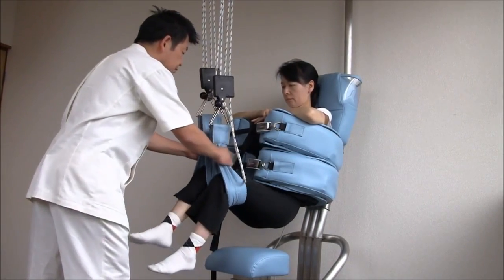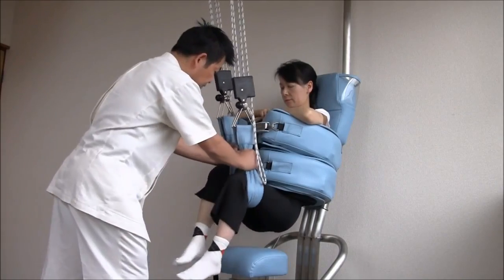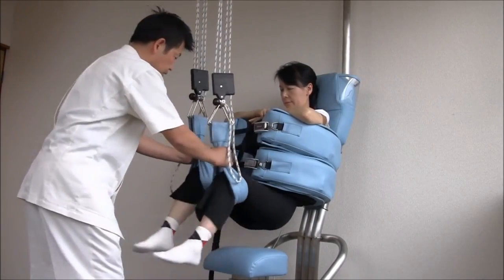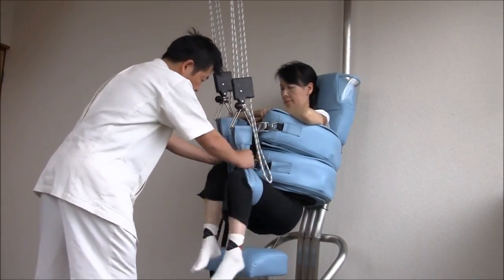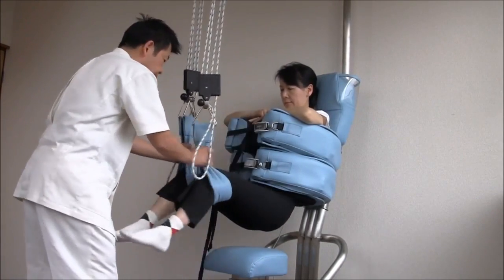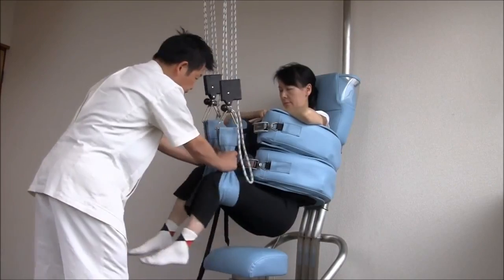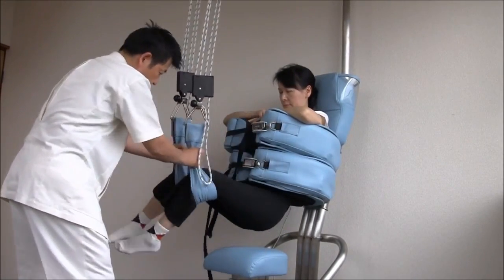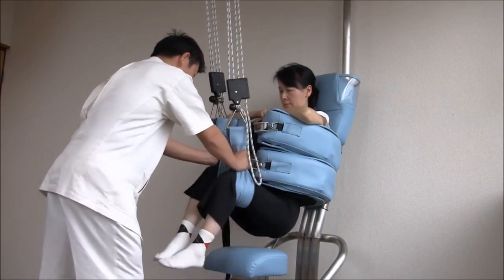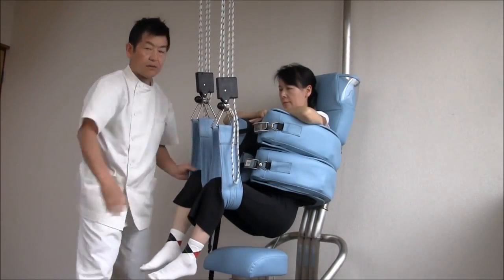Next, do clockwise and counterclockwise rotations. Ask the patient which is more comfortable. If the patient feels comfortable and is without pain, continue. Otherwise, stop the treatment. Please review the video to observe the correct way to perform these maneuvers.